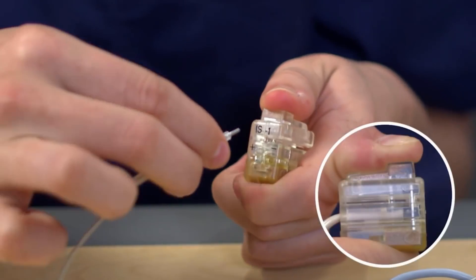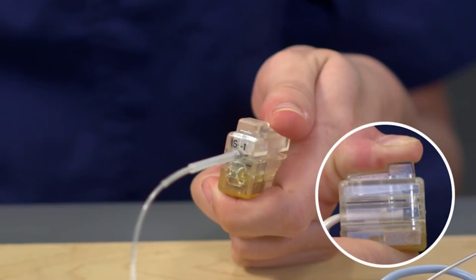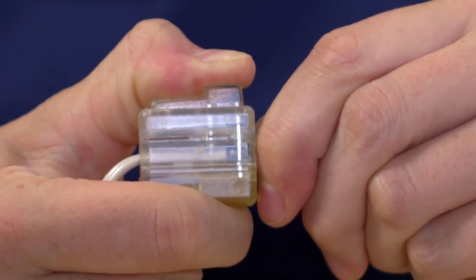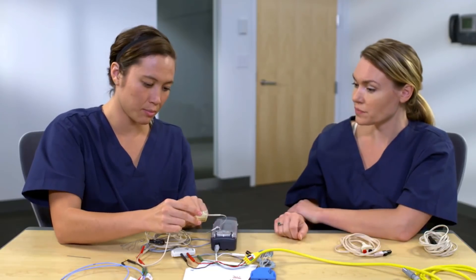To place an IS1 lead, you'll need to depress this button and insert the lead into the IS1 port. How do I know it's secure? You'll need to verify through the side window that the lead pin extends beyond the connector blade. I see the lead pin is secure now.